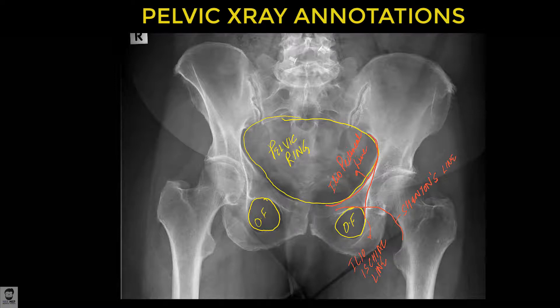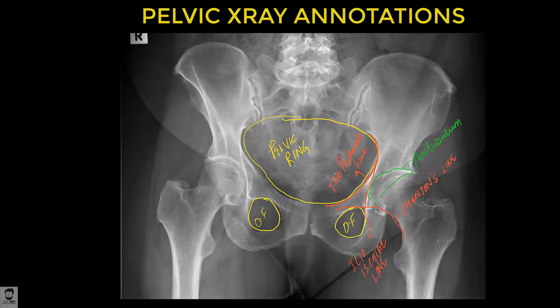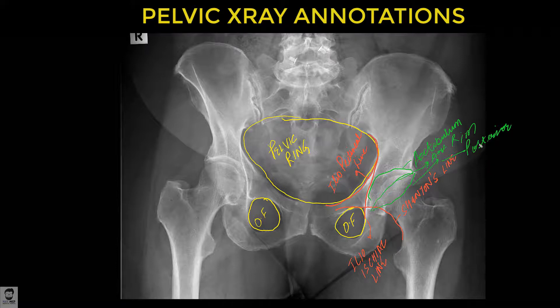Now we identify the acetabulum. You also need to identify the anterior and posterior rims of the acetabulum — that's the anterior rim and that's the posterior rim, so that's the anterior rim of the acetabulum.